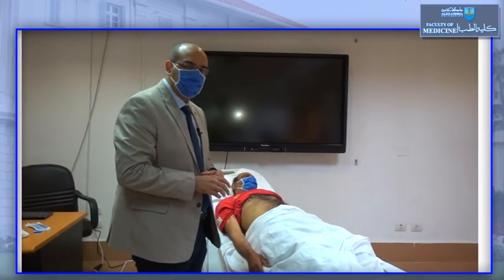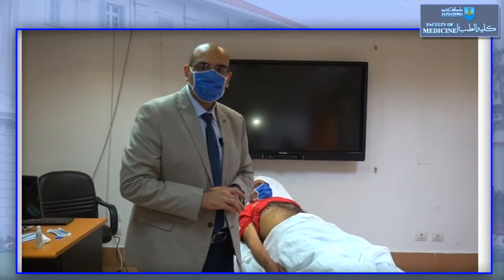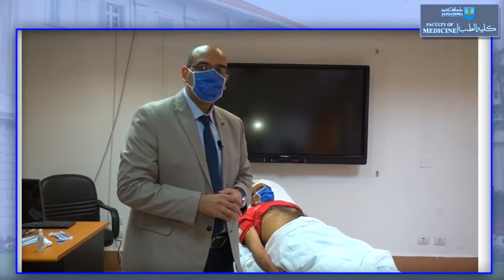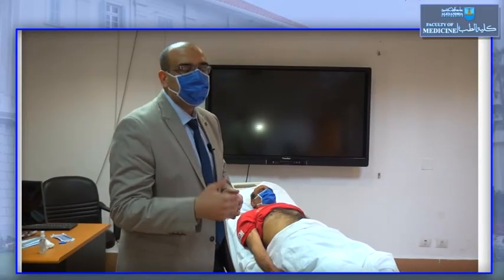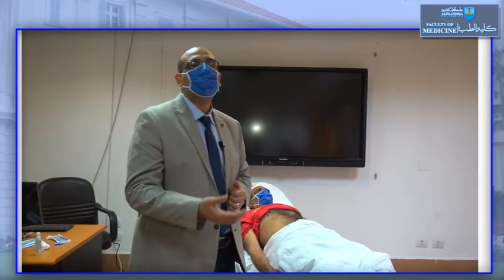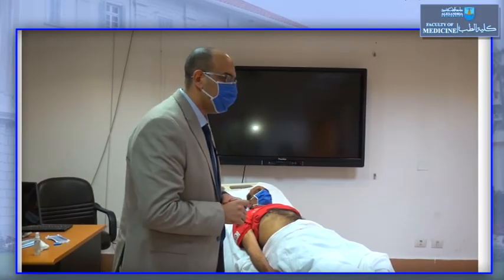To remember, when we are doing vital signs during blood pressure, don't forget the correct position of the patient, to make him supported and at rest first, and then we do the palpatory method, then the auscultatory method. Don't forget to measure the other upper limb and the lower limb, and after letting the patient stand for 1 to 2 minutes. This is very important to remember.